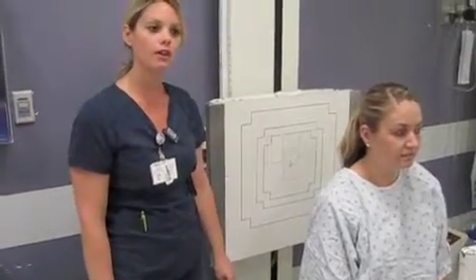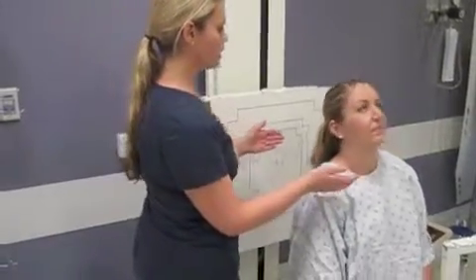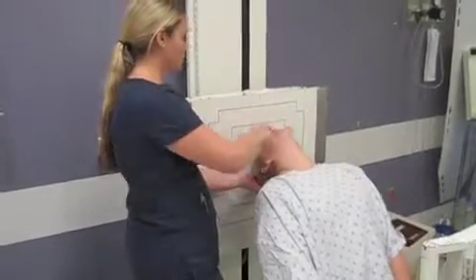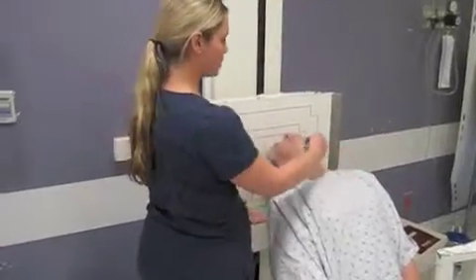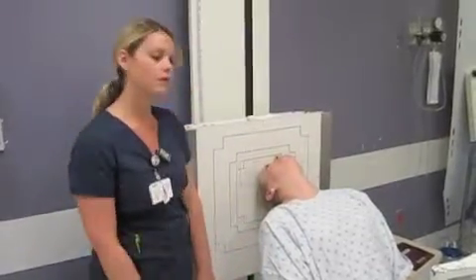Now I'm going to do what we call the SMV. She is going to tilt her head back. We're going to do the IOML, which is this line here, parallel with the bucky. And the central ray is going to enter through the angles of the mandible.